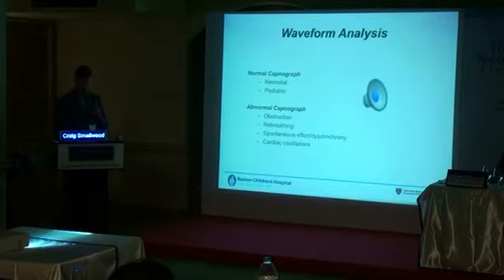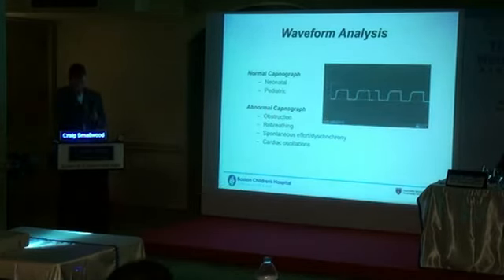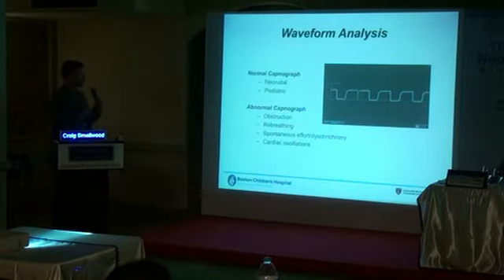Okay, so I have a special device. I'm going to get my phone, and I'm going to show you what a normal CO2 waveform looks like, hopefully. I'm just kidding. It's an animation. But that's basically a normal CO2 waveform, where I think we're pretty familiar with that. That's probably a more term newborn or a little bit of an older child. But we're going to look at some of those, as well as the abnormal here.